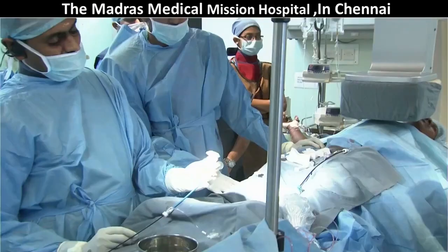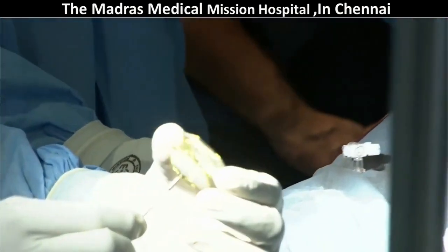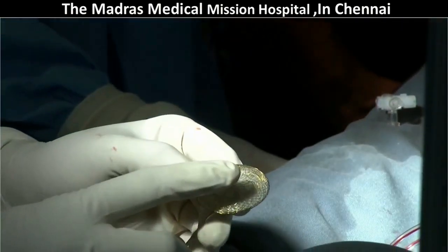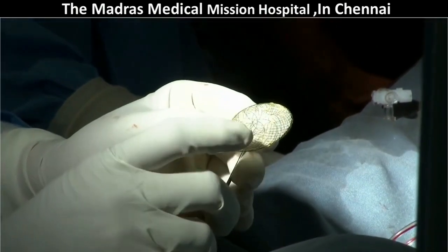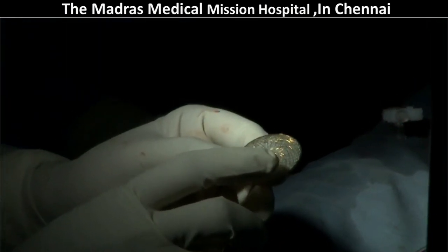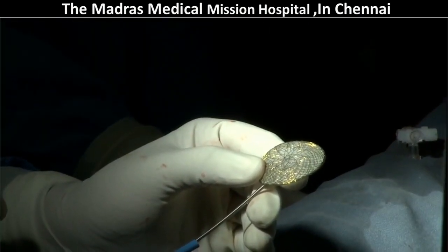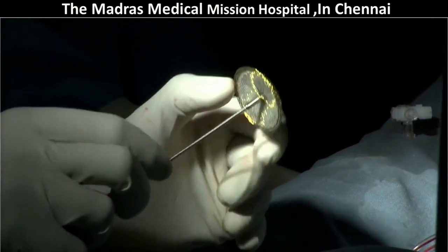The Occlutech ASD device is something similar to the Amplatzer device, but there are a few small differences. The left atrial hub is absent, and the left atrial hub, which is a small stainless steel hub, will be, theoretically, a potential source for a left atrial side thrombus. So here that is less likely.